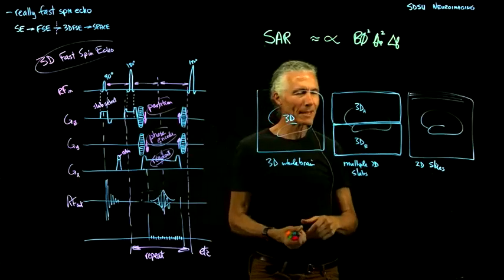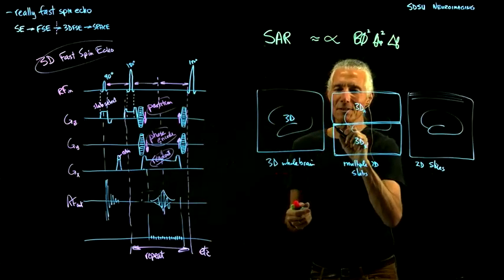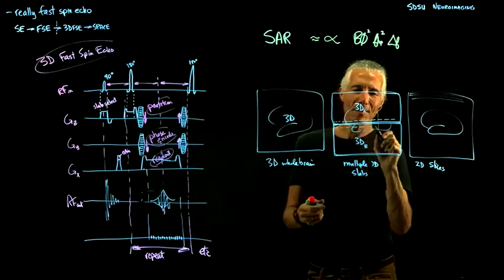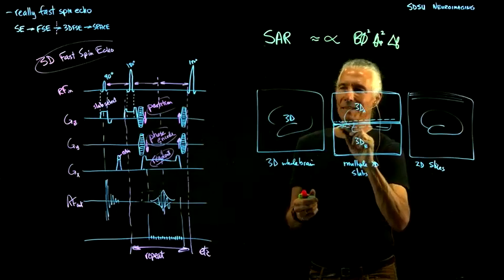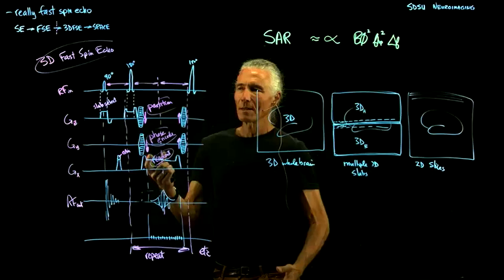But the problem is, the boundary is kind of a mess. And so you can record a little extra and then overlap them and throw away some of these. And so this sequence was around for quite a while.